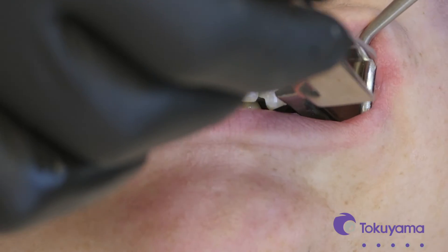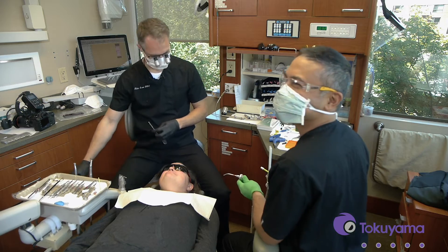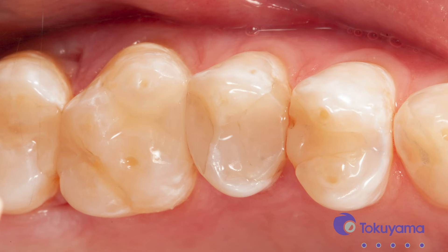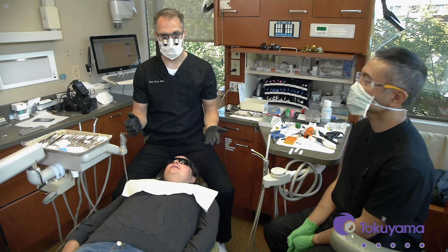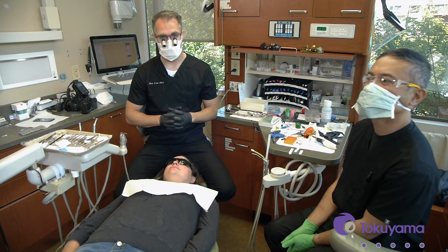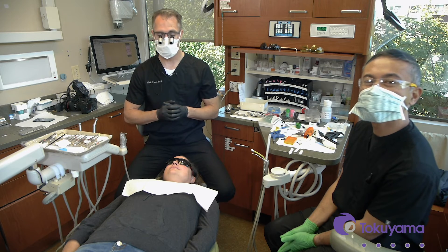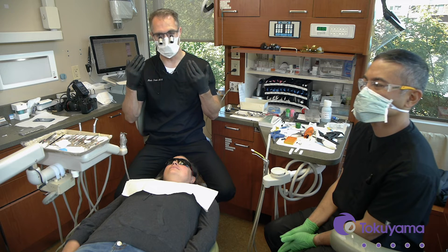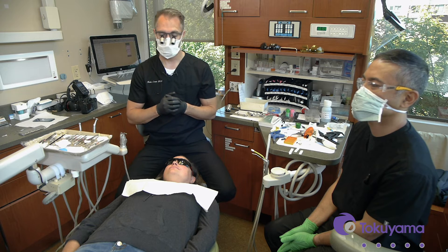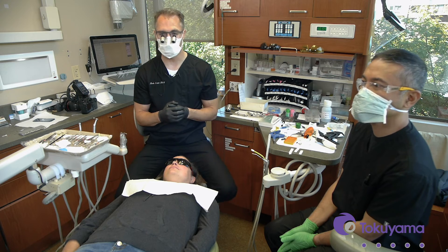Bite down, grind a little bit. The occlusion looks good. We put in just a little bit of anatomy to finish it off, but even if you don't put the anatomy in it still blends in perfectly. The teeth are a little dehydrated, so once things get fully rehydrated it's going to be a seamless blend. It's a great restoration, especially when you get up onto the premolars where you have a little bit of an interproximal box that's going to be visible in the smile. Those composites can darken over time, especially if the patient decides to whiten their teeth. This is a great composite because it blends in with the tooth — as the teeth whiten or darken, this composite is getting its color from the tooth itself, so it's going to change with it and always be a spot-on color match.